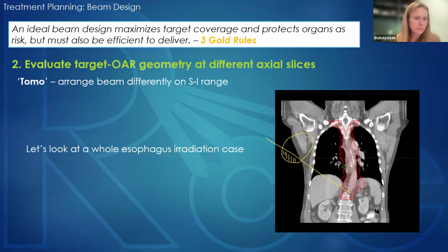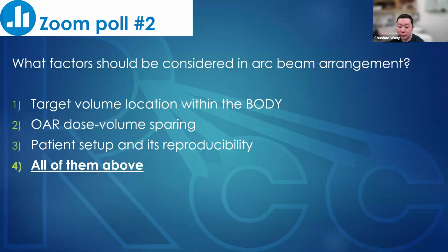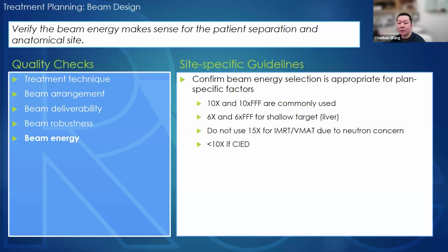Let me see if we can clear the annotate. Okay, so we just finished our Zoom poll. All right, so let's resume on the beam design part. And the last thing is the beam energy. So we want to confirm the beam energy selection is appropriate.